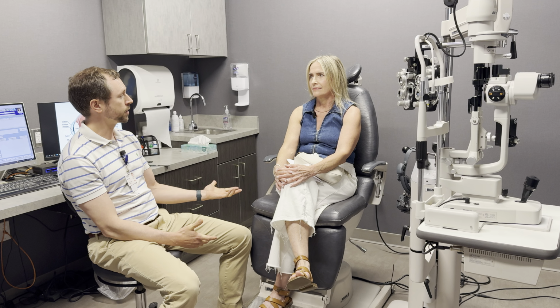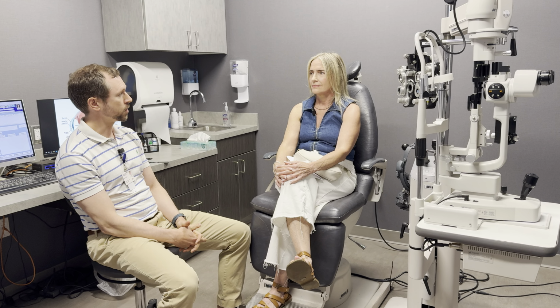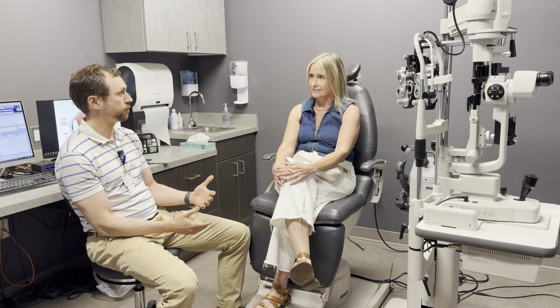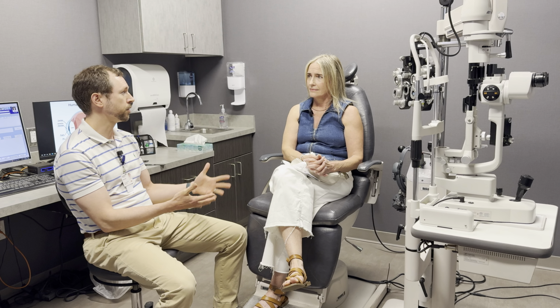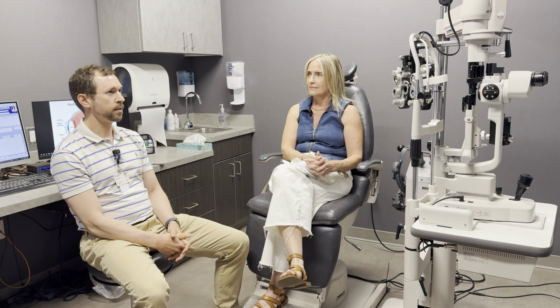But I think that particular multifocal lens is more tolerant to subtle residual refractive prescriptions. So in an RK patient, if you think they're going to be more likely to have a refractive error, they sometimes will do better with an Odyssey multifocal. And in your case, we still hit the nail on the head, but my point is that gave us a little bit more freedom to go for an Odyssey multifocal in you because you liked it in contact lenses, you had very regular topography, and you had very reasonable expectations.